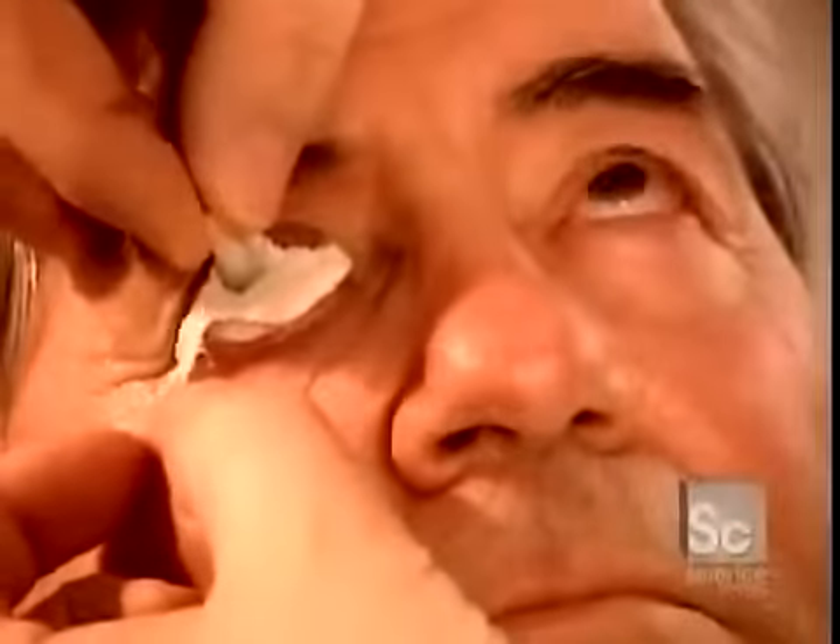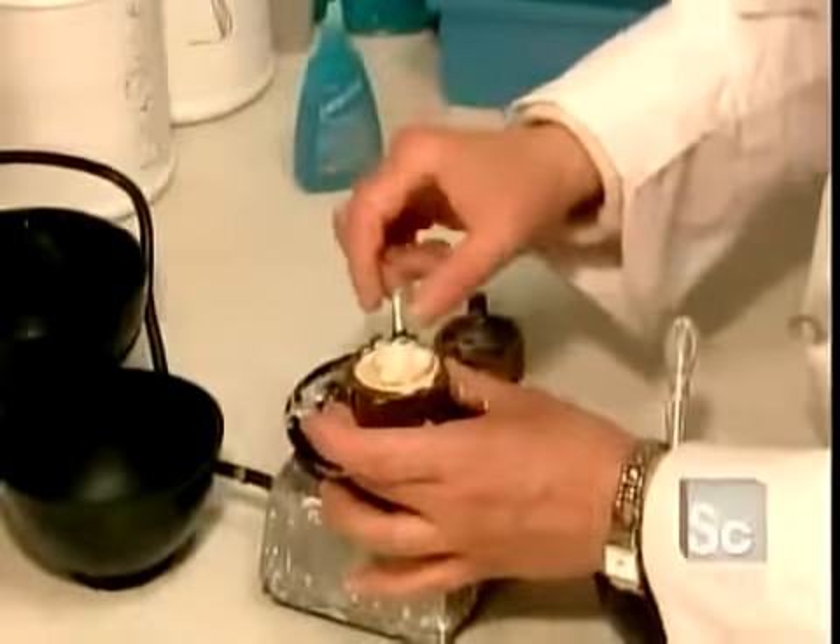No two people's eye sockets are the same, so the first step is to take an impression. After inserting an impression tray, they inject a material called alginate, filling the entire socket cavity. After 90 seconds, the alginate sets, and they can remove the hardened impression.